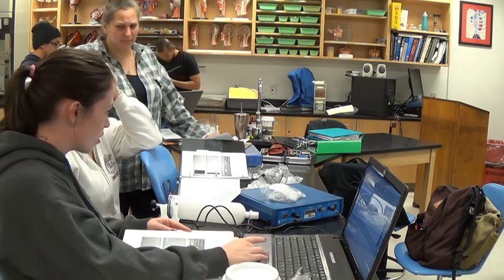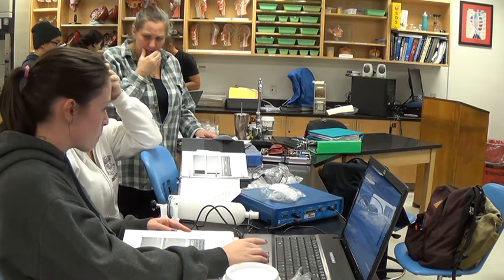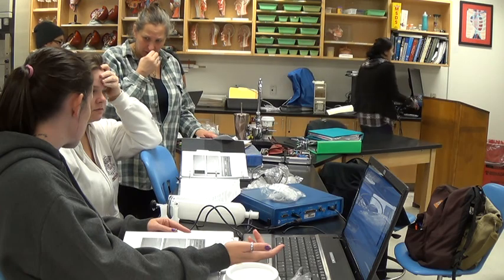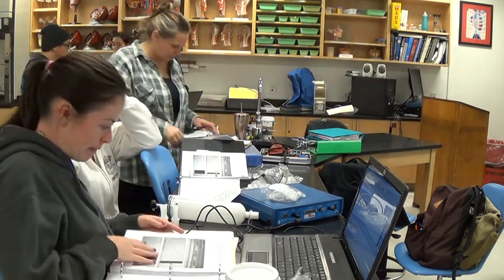One each way. If you breathe in 500 milliliters, then you'll be breathing out 500. I thought tidal volume was for both in and out. No, it's just for one direction. We still got a negative number, even with 500? We got a negative 50.